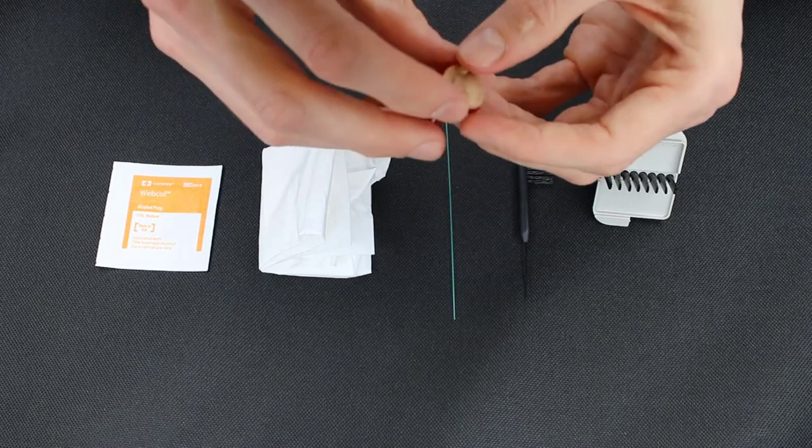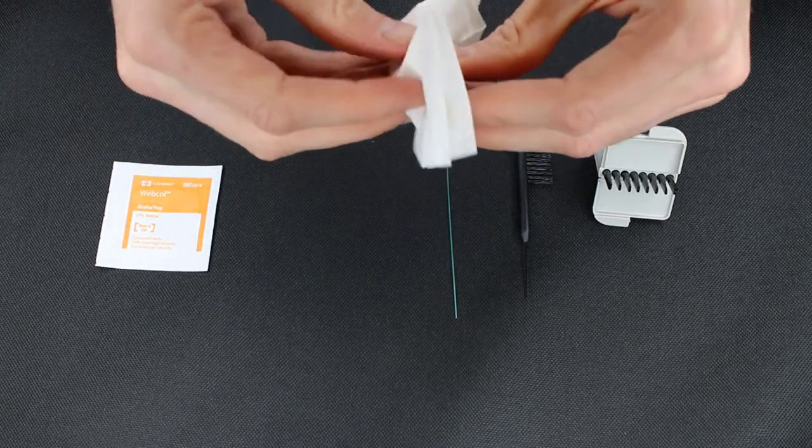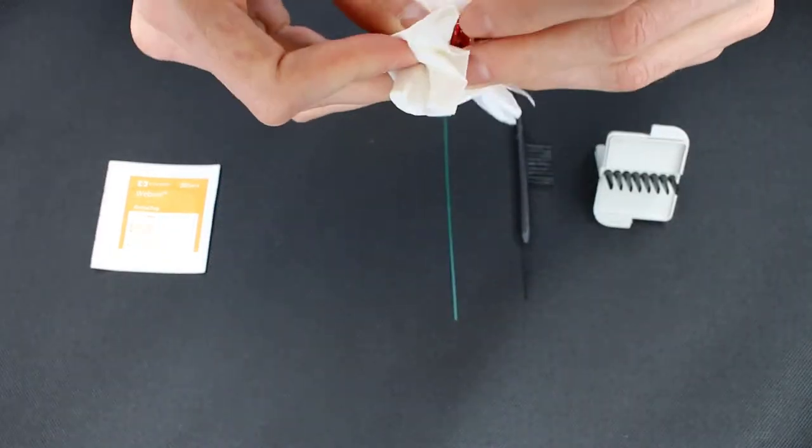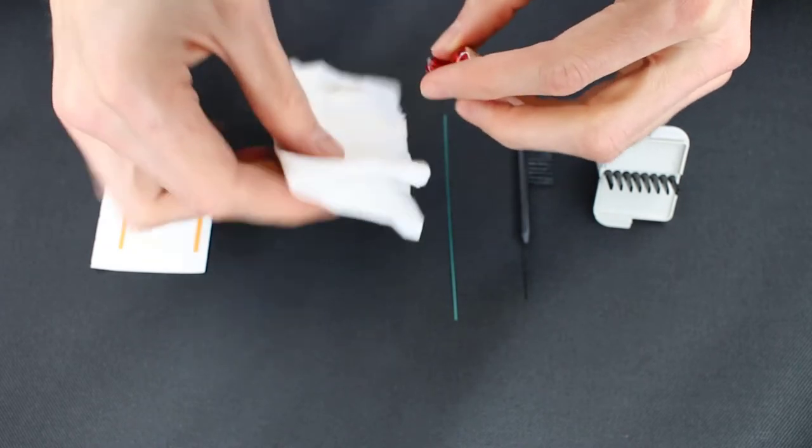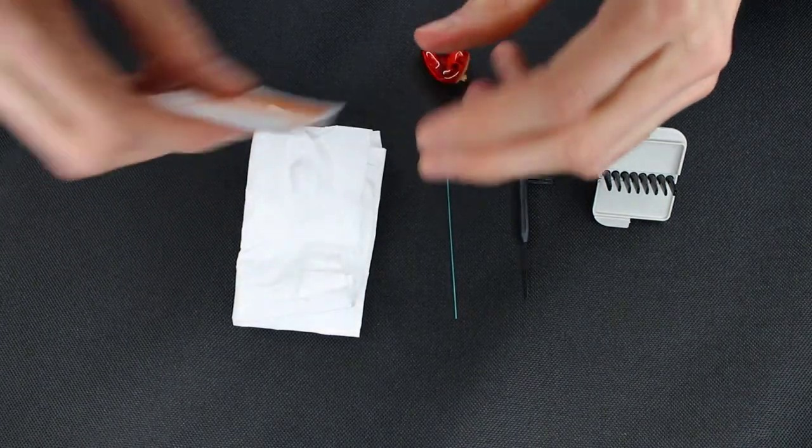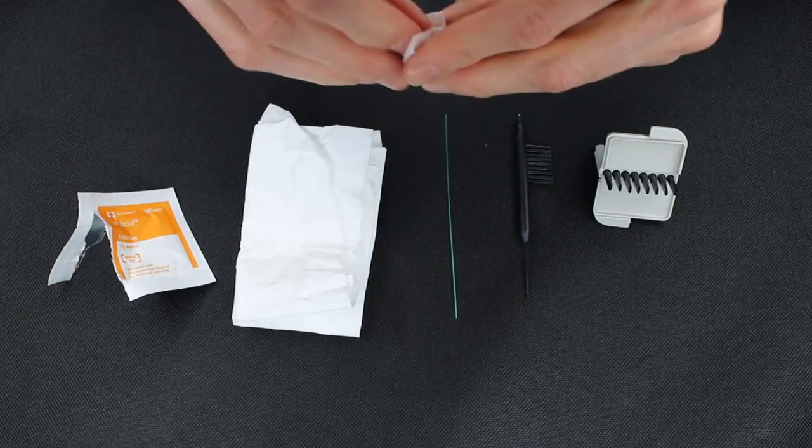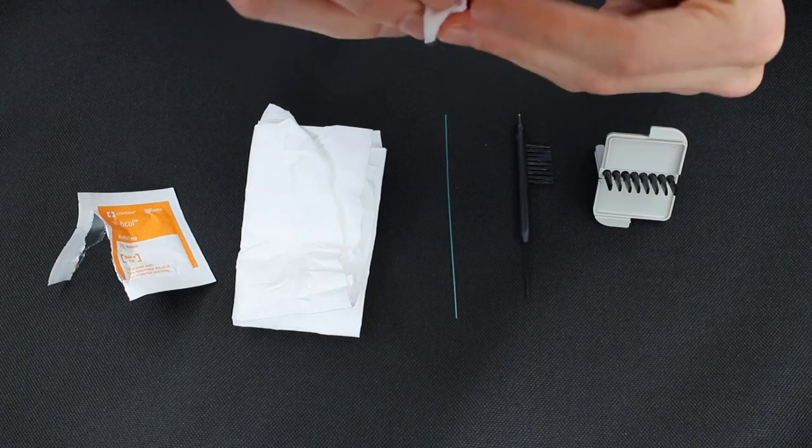So we're gonna start off at first, and we're gonna give the hearing aid a wipe down. Any type of earwax that would be on that hearing aid, we want to make sure that we get the big chunks of it off. And of course, if you are the type of person who likes to make sure that the hearing aid is disinfected, we would use an alcohol swab or alcohol pad and clean it off with that.